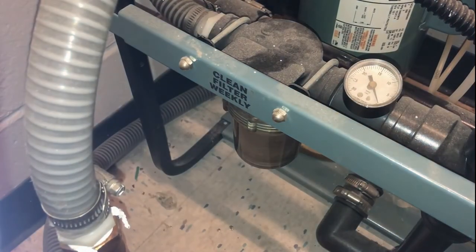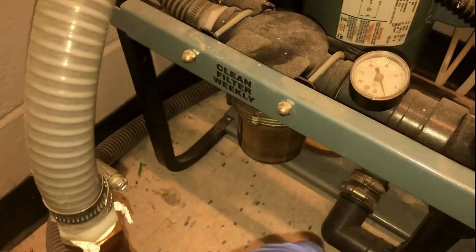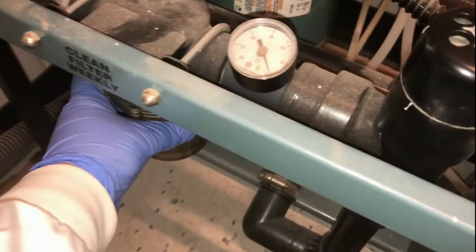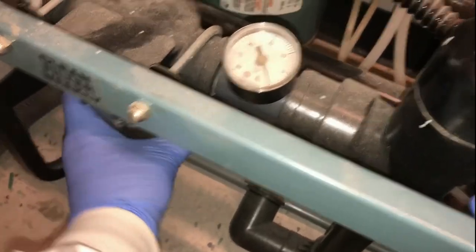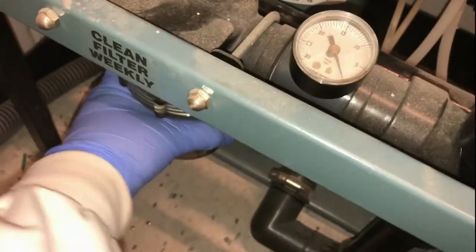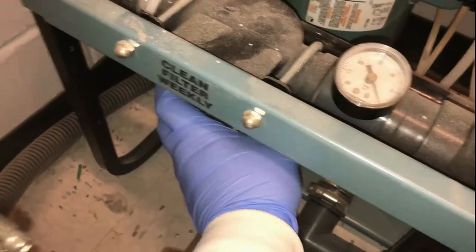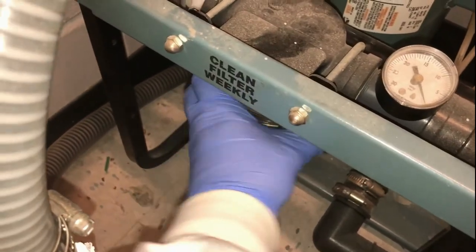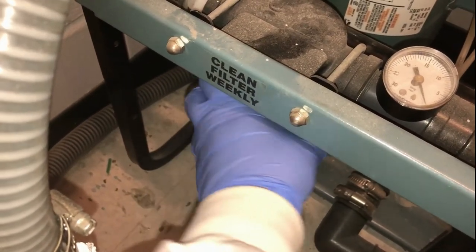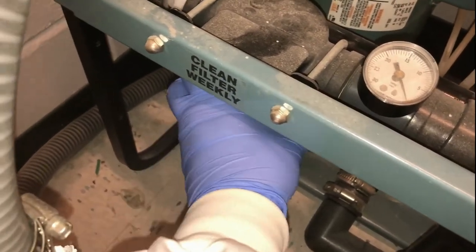The last trap to check is the central vacuum trap. Remove the plastic container that contains the filter and the debris. And check to see if the trap is dirty.